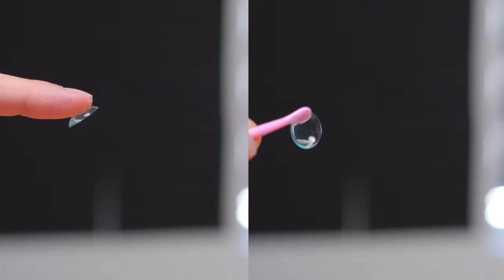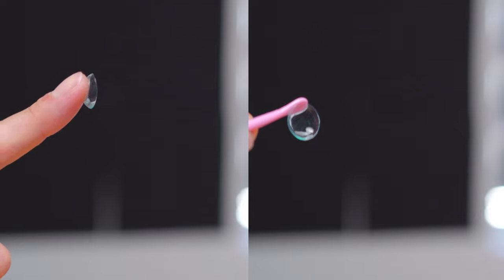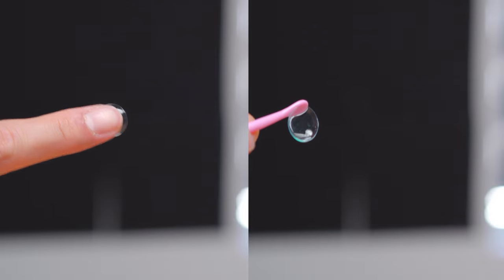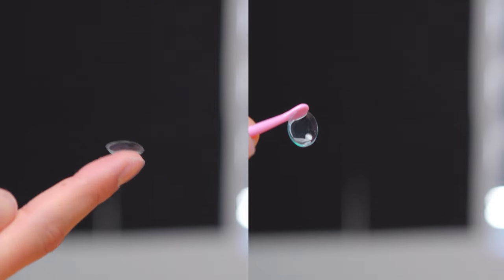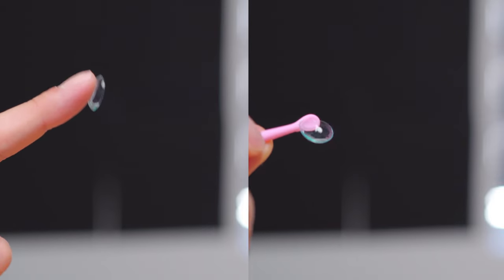I wouldn't say it is easier to use this tool over my fingers. With my fingers, I can maneuver the lens in all the different axes. However, with a tool, I do not have the same flexibility — it will just fall off. I can understand that if you're in an area where you cannot easily wash your hands, something like this is a very hygienic way of putting your lenses in. But for the average contact lens wearer, I would not recommend this product as it can be a safety hazard, especially if you're not used to using things close to your eyes.